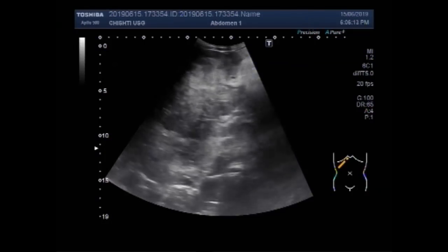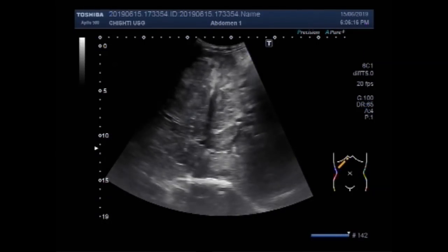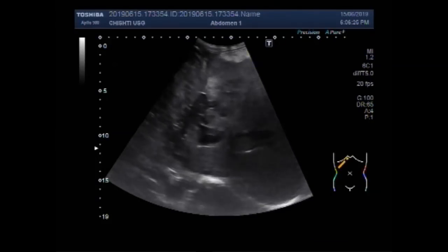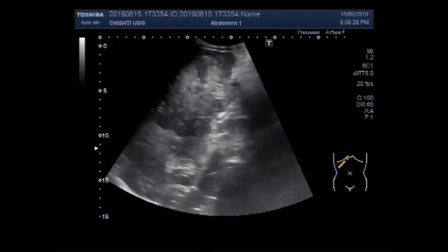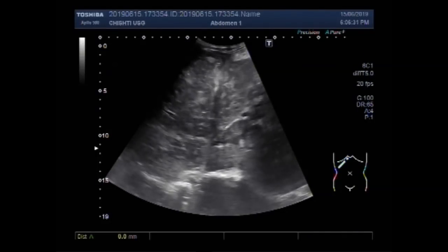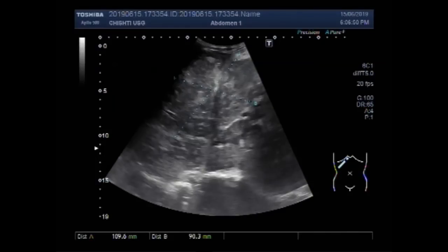Now again you can see the hepatic mass. It measures about 11.0 by 9.0 cm — quite a large mass — having heterogeneous echodensity, semi-solid to solid in consistency, and seen in the upper portion of the left lobe of the liver.